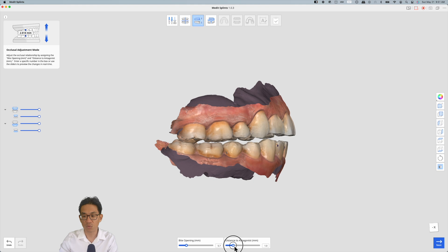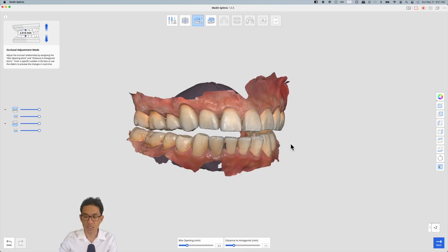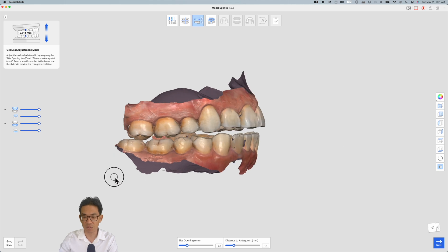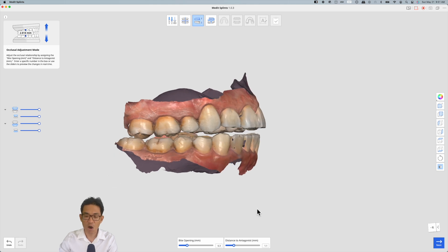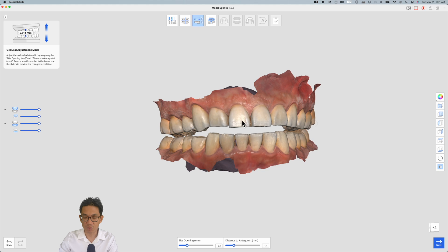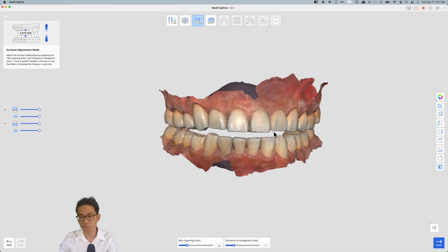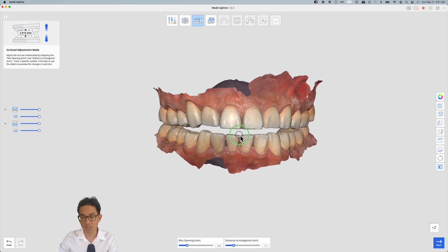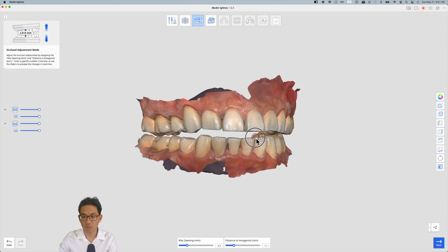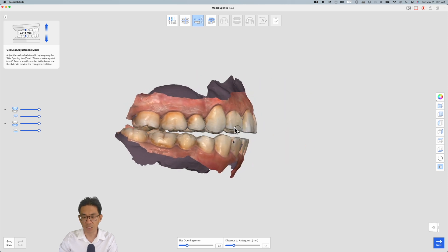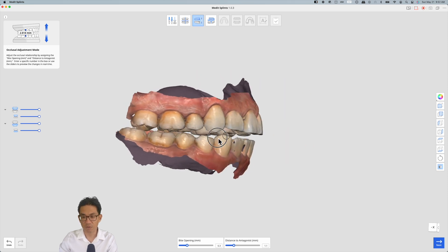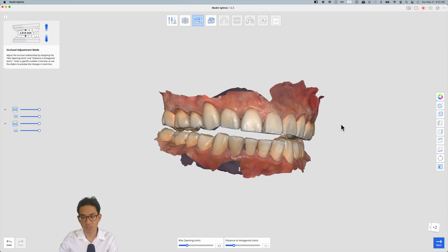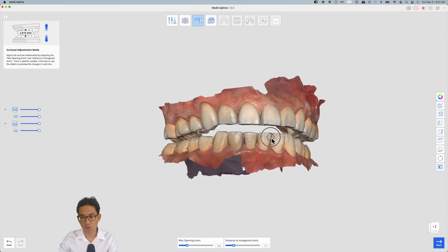I will say the scan was taken with the teeth in full occlusion. However, there are other methods of capturing the bite using a leaf gauge or maybe a Kois deprogrammer or even cotton rolls that people suggest to get the proper articulation.